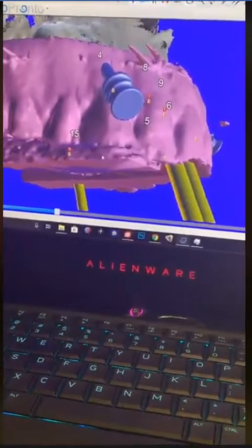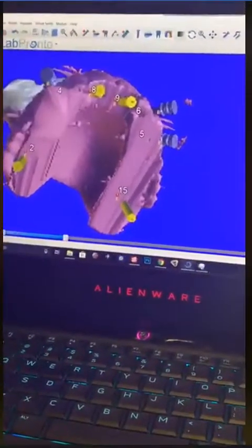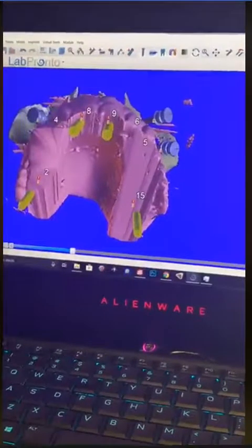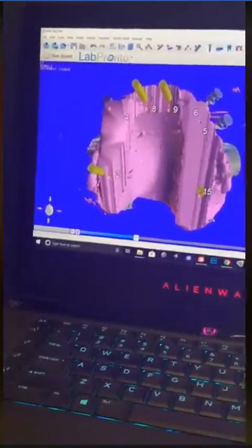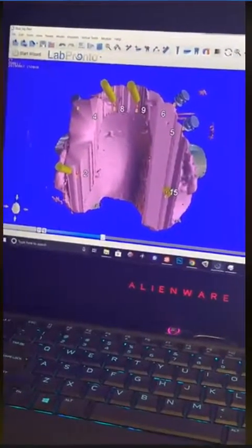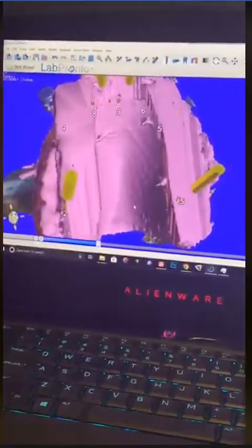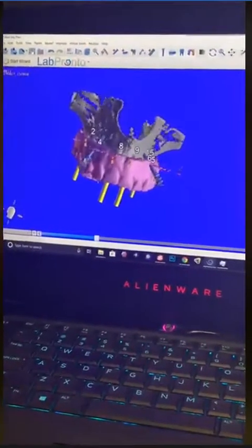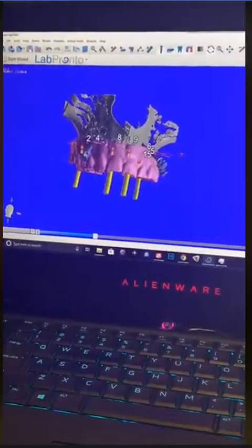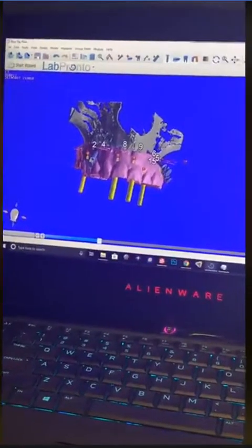Okay, I want something where I can only see my denture and nothing else, so I can take a look at the occlusal level here. This area, I cut it away. That's why part of the tooth is missing. Okay, but I want to take a look at a cross-sectional and axial view on my 3D, see exactly where it's coming from. And now I have this entity that's sitting here and does not allow me to see exactly where these implants are merging into the denture. So anyway, that's another beef I have with the companies that make these CBCT machines. Anyway, let's move forward.